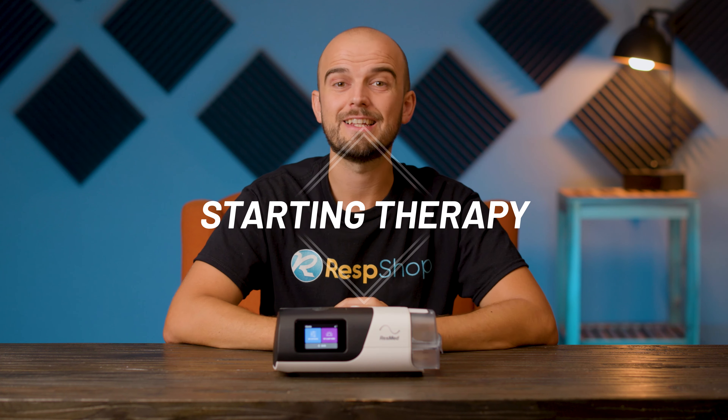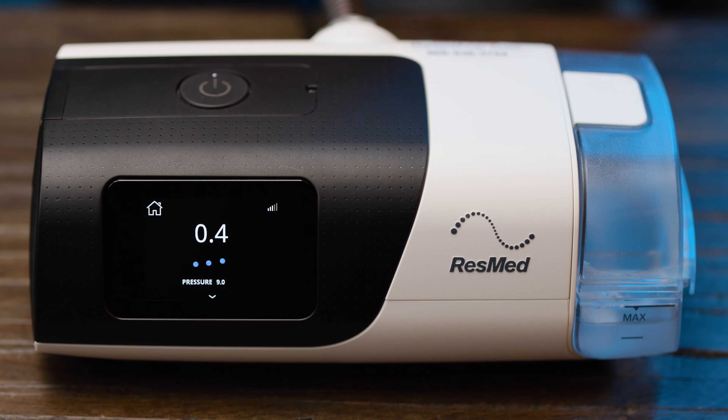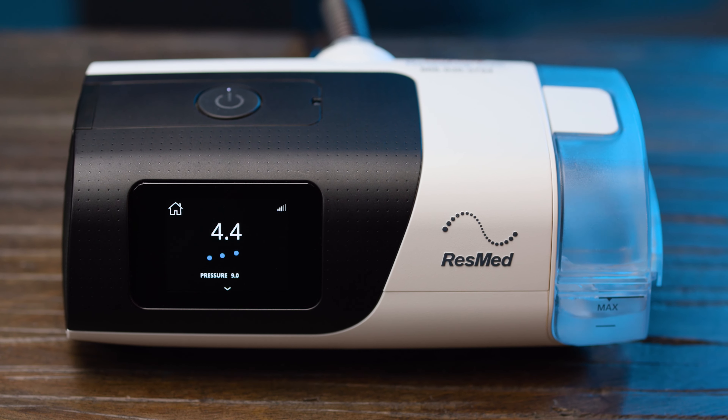Last, but by no means least, is the Start-Stop button at the top of the unit. If you have Auto-Start-Stop activated, you might not need to use this, but if you don't, you'll need to press this button when you're ready to begin therapy. Although, as with everything else on the menu, this can also be done in the MyAir app if you have it connected with your machine.